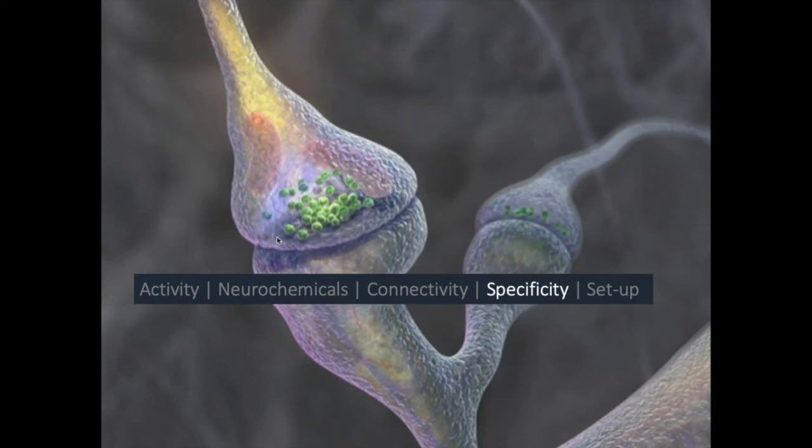That's probably a little bit of a detailed spectroscopy question for here, but broadly creatine or absolute concentrations are probably the way to go, and it's not clear which is better. Certainly we do them, we look at all our relationships, all our changes in relation to creatine and water, and make sure that it doesn't matter which one you reference it to, you get the same pattern of results. And I think that's probably the sort of neuroscience sensible way of dealing with that question. Excellent. Thank you very much.